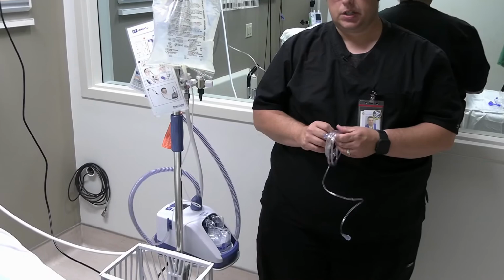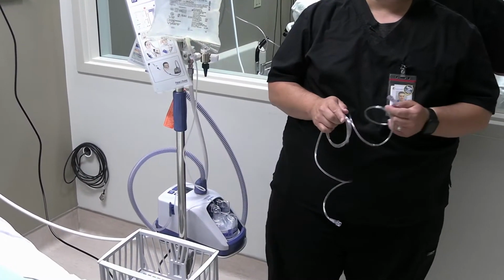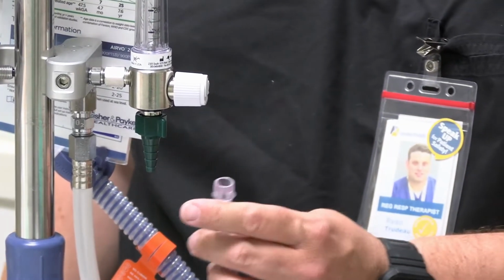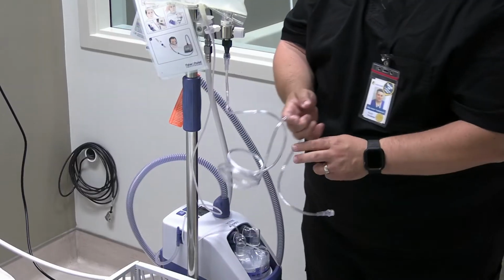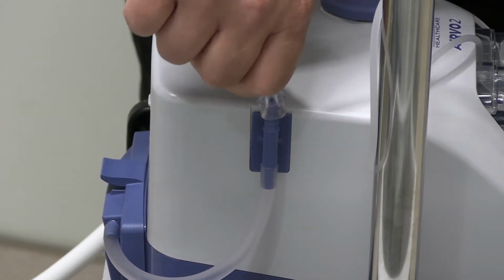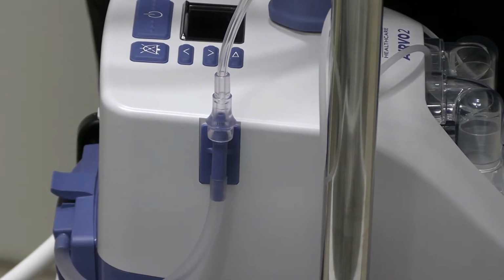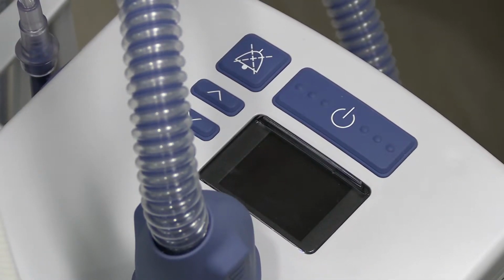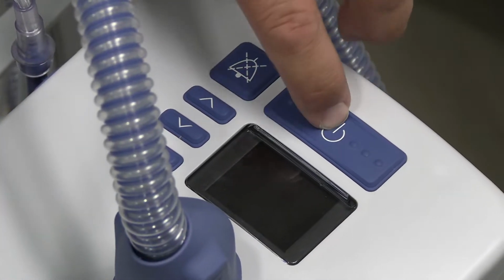So our next connection is going to be the oxygen tubing from the flow meter to the device. So taking the one end of the oxygen tubing, you're going to attach it to your flow meter. You're going to take the other end of your oxygen tubing and you're going to attach it right back here into the device, just like so. Once we have the oxygen hooked up to our device, we are going to leave the flow meter off for right now. But we are going to power on the device because it does take a little bit of time to heat up.